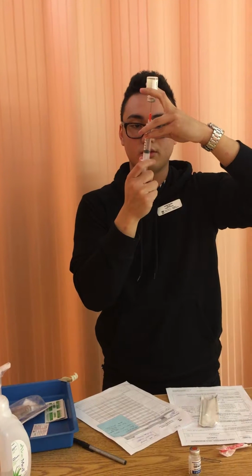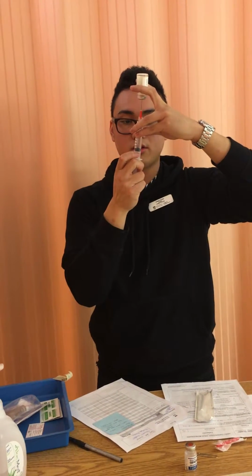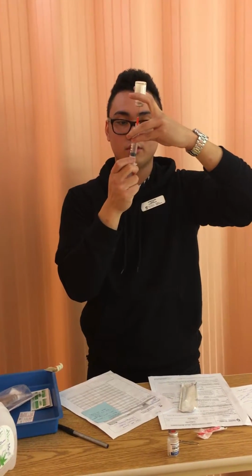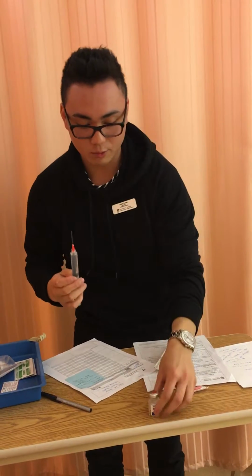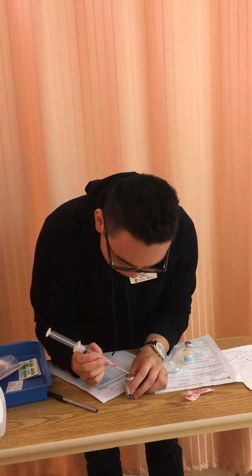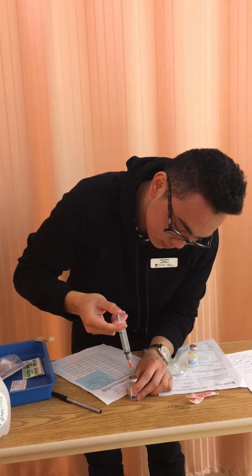Okay, we have 10 mLs of water. Okay, and we've already swabbed the top of this and let it dry, and now we will instill 10 milliliters of sterile water into the vial here.